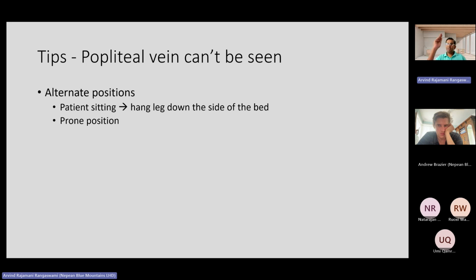So if that's the popliteal fossa and this is the probe transducer, you are going to compress in that direction towards the sky, towards the ceiling. When you have particularly an obese patient who's supine, remember that the popliteal fossa or the leg is actually going to fall down towards the floor. So if you're keeping the transducer there, it is extremely common for the gravitational pressure of the weight of the leg to automatically compress the vein on the transducer.